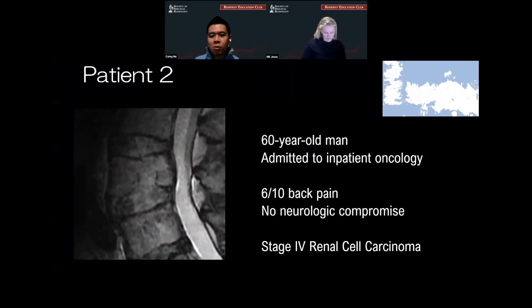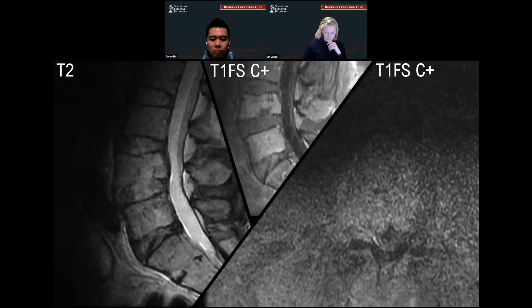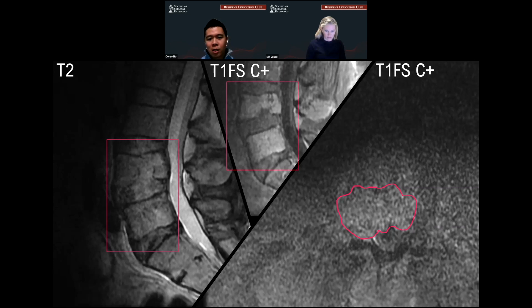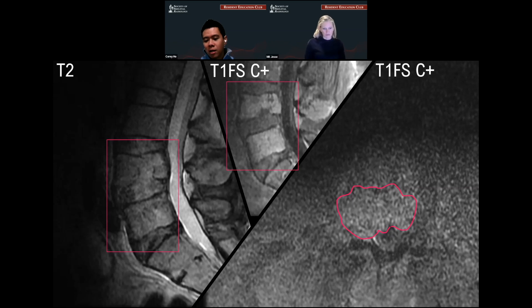Patient number two is a 60-year-old man admitted to inpatient oncology with 6 out of 10 back pain without neurologic compromise. The patient has a history of stage four renal cell carcinoma. On the presenting inpatient MRI images, on the T2 sagittal images there is abnormal signal within the L4 and L5 vertebral bodies. On the sagittal post-contrast images, there's diffuse enhancement within these vertebral bodies. There's also disruption of the inferior end plate along the L4 vertebral body, and an enhancing soft tissue mass within the L4 vertebral body that is encroaching on the spinal canal and definitely compressing the right neuroforamen.